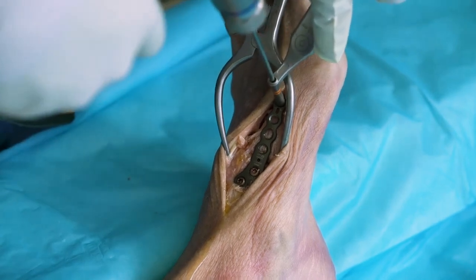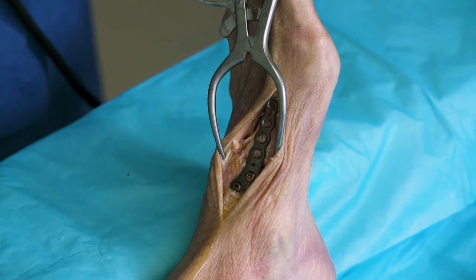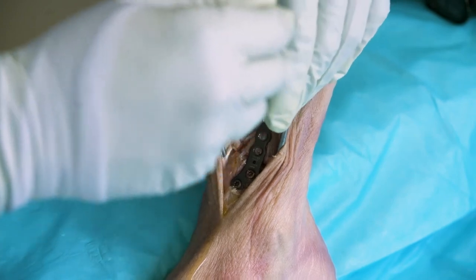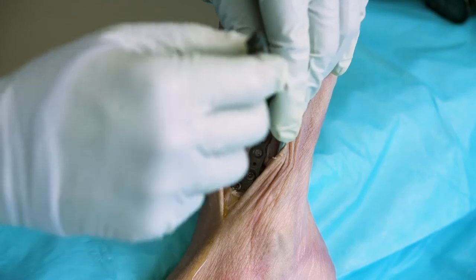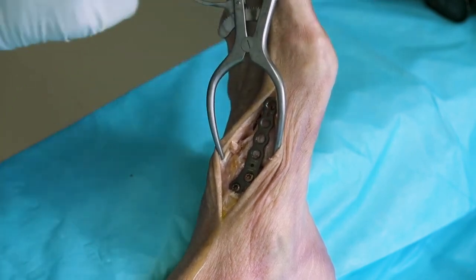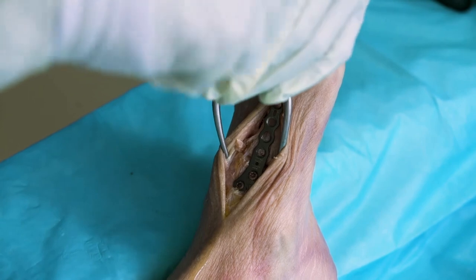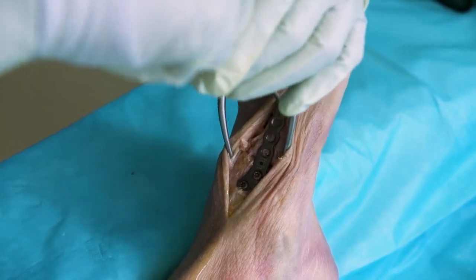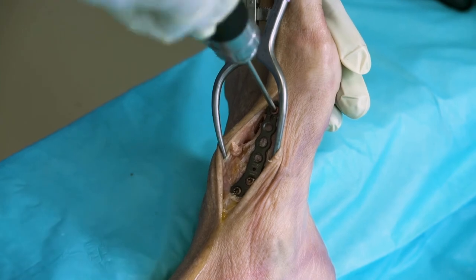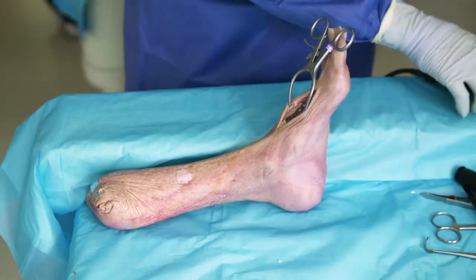I would use 3.5 millimeter non-locking screws in the first metatarsal. We're in the diaphysis of the bone here, and this screw is shorter than the ones we've been using. Keep in mind that the plate is considerably off the bone, so even though we're measuring a 20, if we put in a 16 the screw should be the appropriate size once the plate contours down. This needs to be a non-locking screw in order to contour the plate — a locking screw will simply lock in and won't contour the plate as well. As the screw goes down, you can see very nice contourability of the plate.